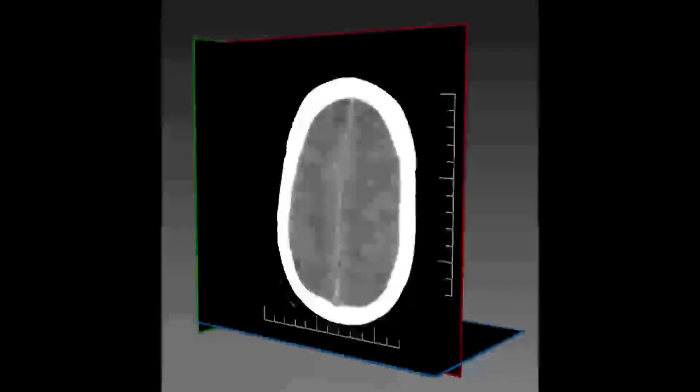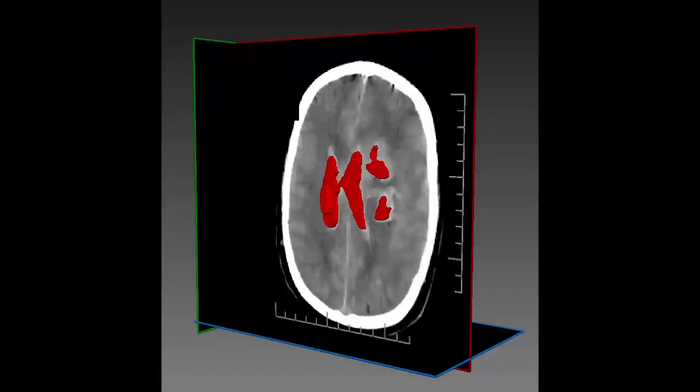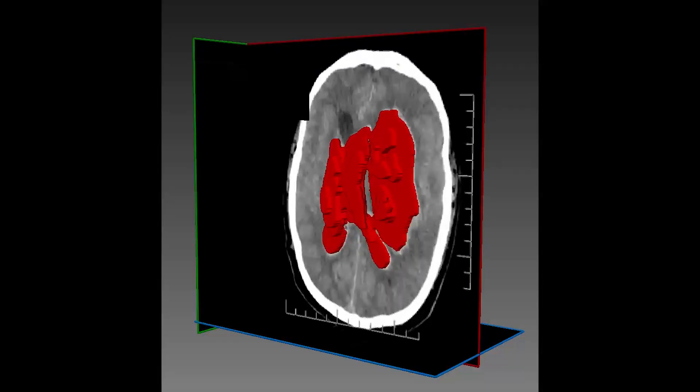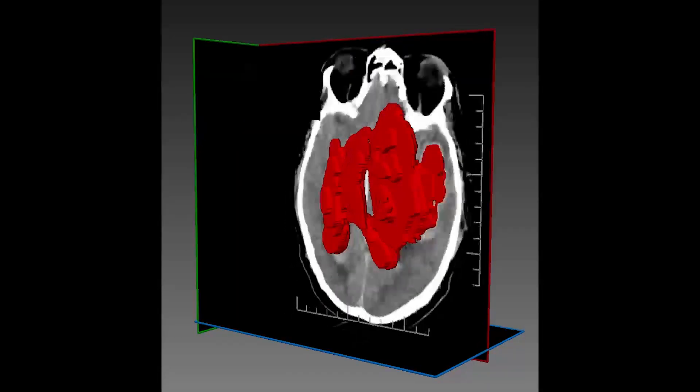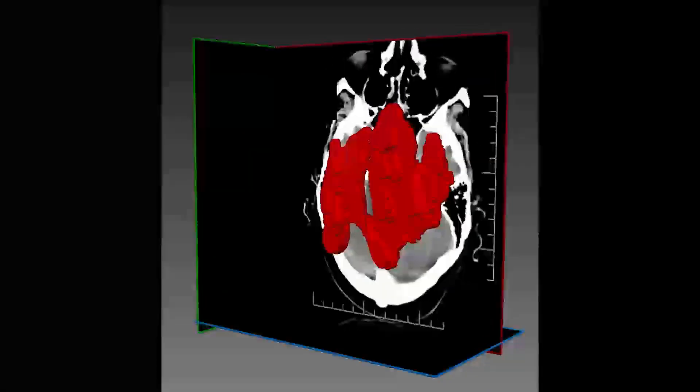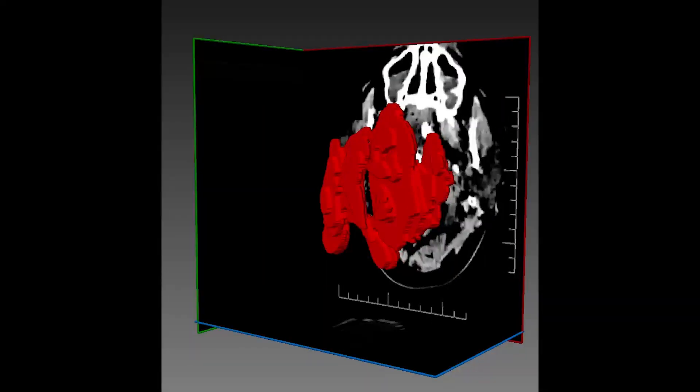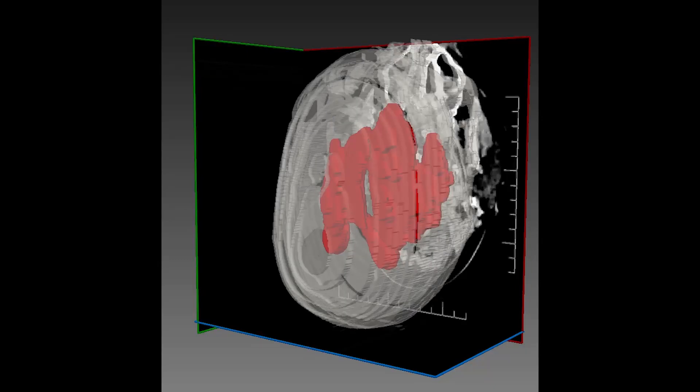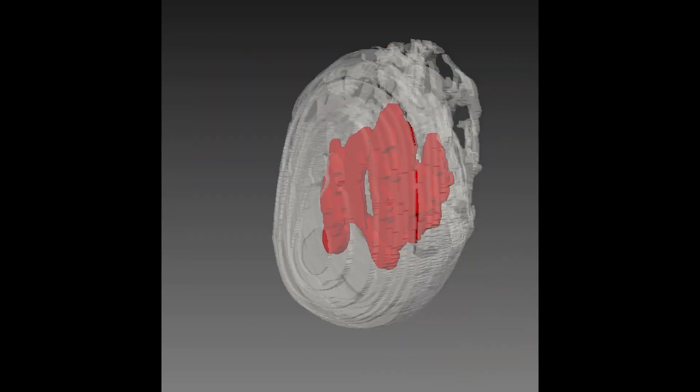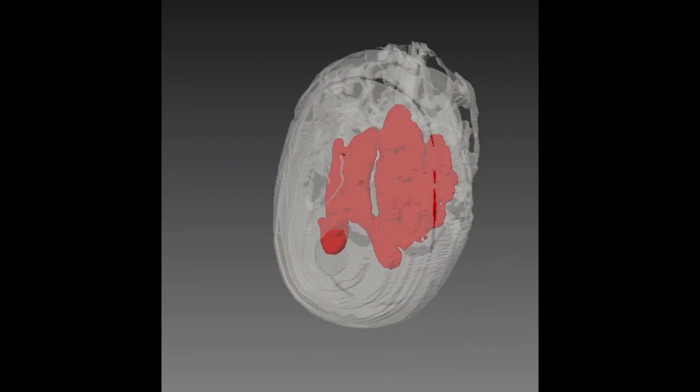As a result, our fully automated segmentation technology achieves fast, robust, and accurate segmentation of multiple cranial hemorrhage types with constant running time.